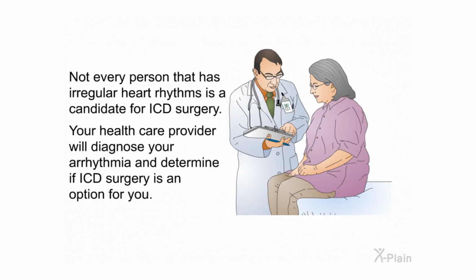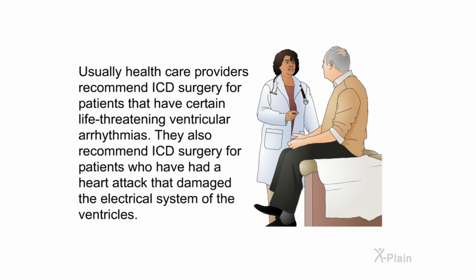Screening. Not every person that has irregular heart rhythms is a candidate for ICD surgery. Your healthcare provider will diagnose your arrhythmia and determine if ICD surgery is an option for you. Usually, healthcare providers recommend ICD surgery for patients that have certain life-threatening ventricular arrhythmias. They also recommend ICD surgery for patients who have had a heart attack that damaged the electrical system of the ventricles.